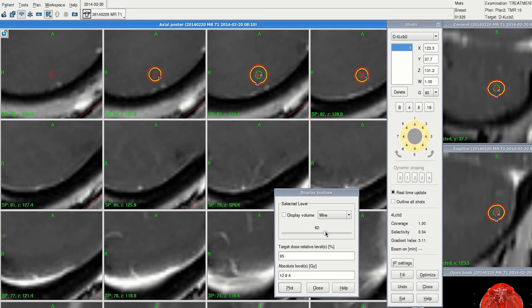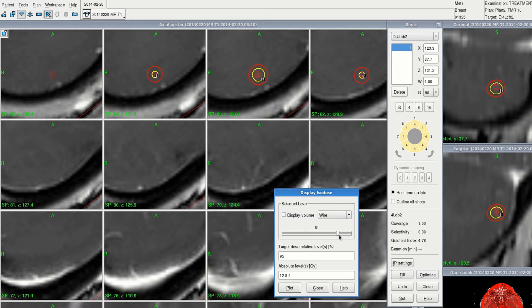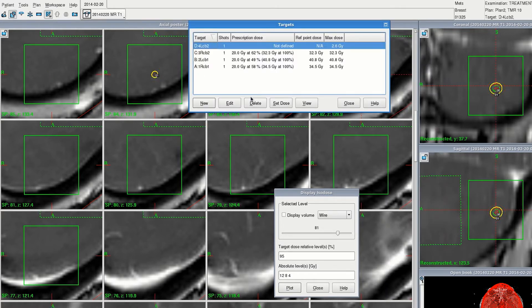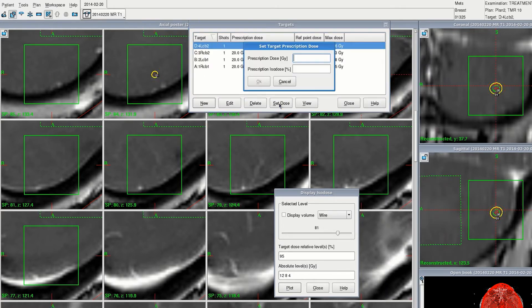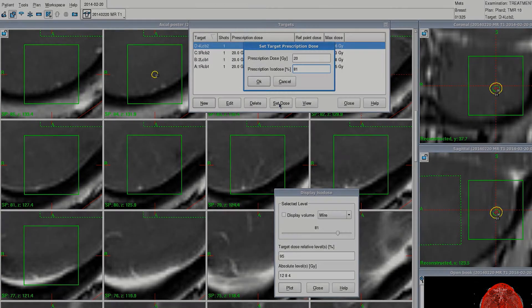And finally the fourth, which we can also manually plan using a 4 mm isocenter. We can adjust the prescription isodose to find a good fit to the target. The 81 percent isodose gives us a good fit, so we'll go ahead and set the dose for this lesion.